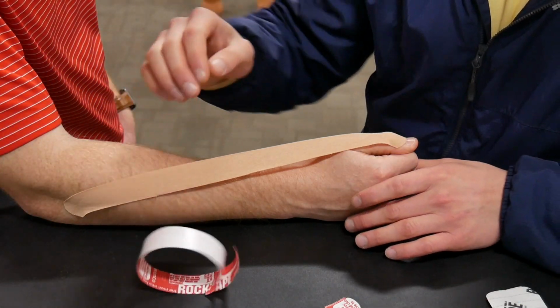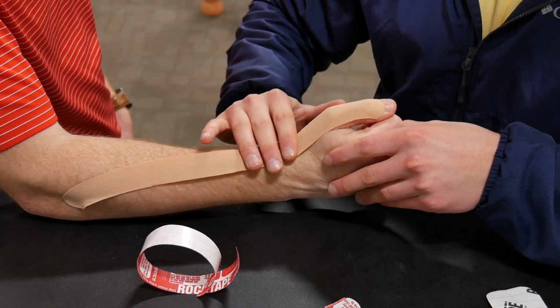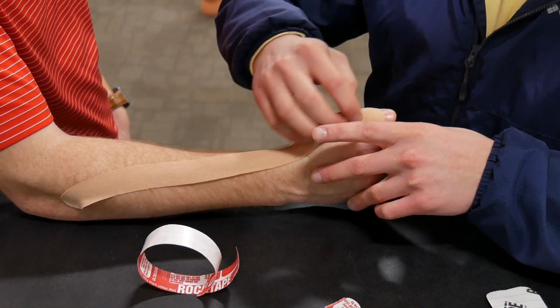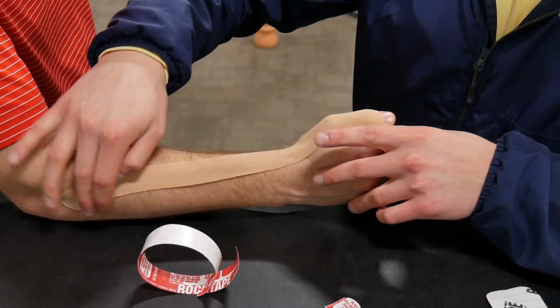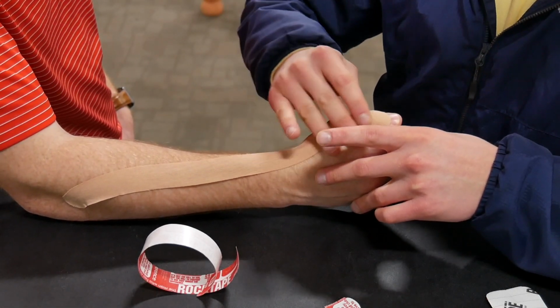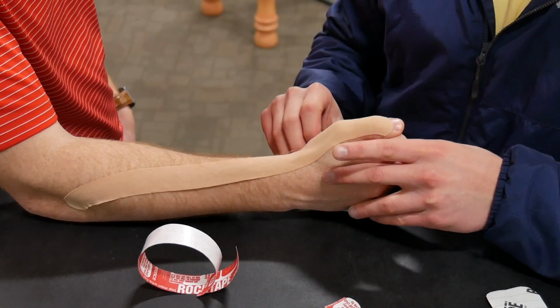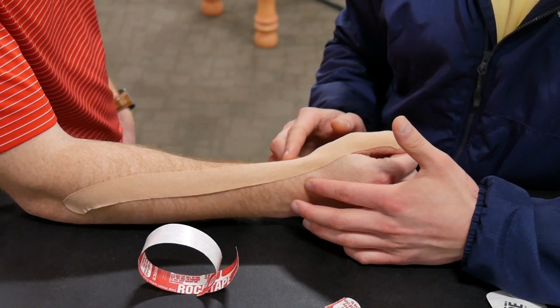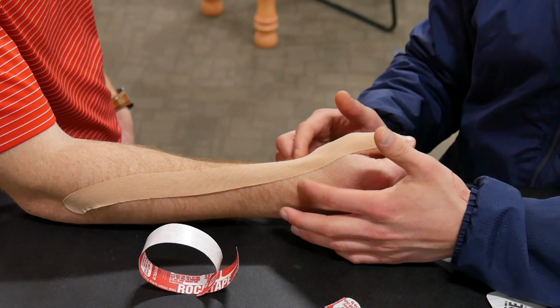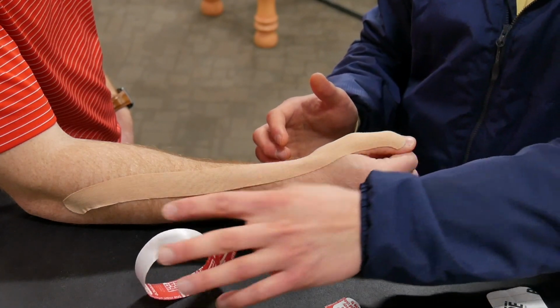And then you can bring their wrist, they're in neutral, you can bring them up into radial deviation, and that just gives you some slack in the tape, just a little bit, to be able to smooth it down. You want to make sure that's all rubbed in really well. Activate the adhesive, make sure it's anchored, nice and smooth, all the way up. Okay, so that's the first piece, nice and anchored. And at this point, when they come back into neutral, you can already see how this tape is starting to lift this area. And that's the idea behind this, is really to lift the tissues on the radial side of the wrist to relieve the pressure that is on that side of the wrist.